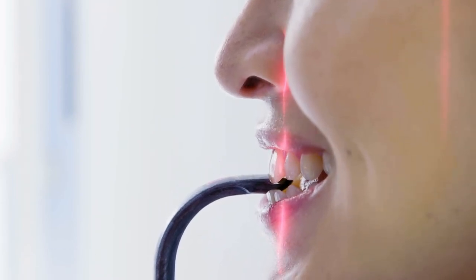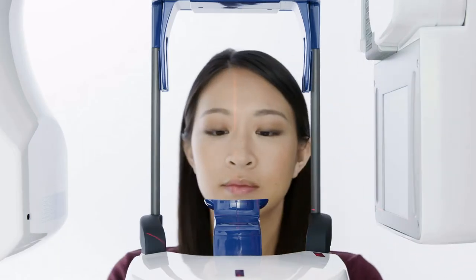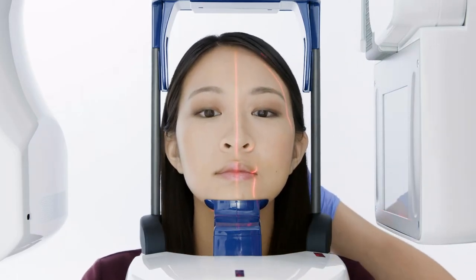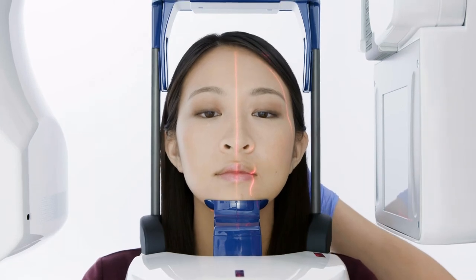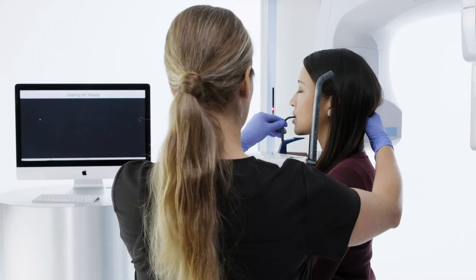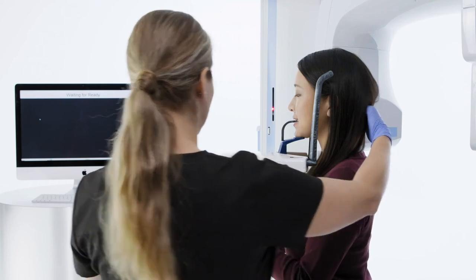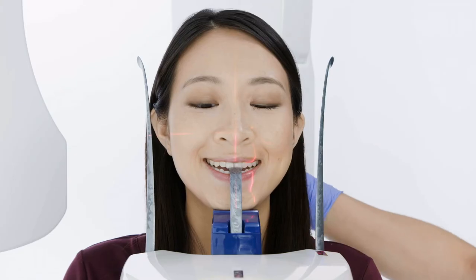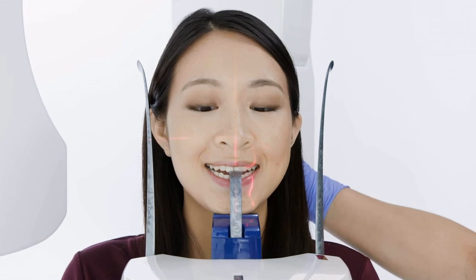The patient may also be positioned using the chin cup. The chin cup will keep the patient in occlusion. Use cotton rolls to open occlusion if needed. Lower the bite stick so the patient's chin is resting on the chin rest. Verify the cervical spine is stretched by gently lifting up on the back of the patient's head.